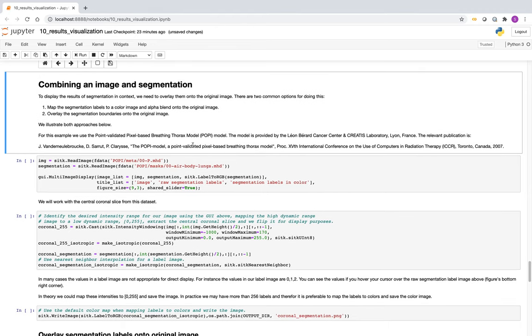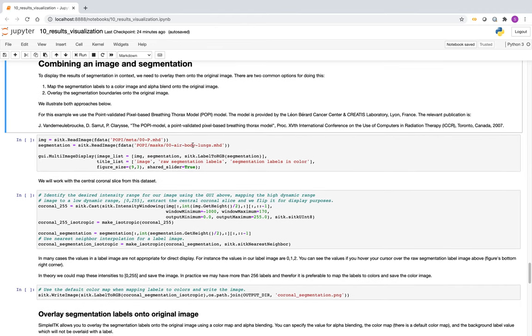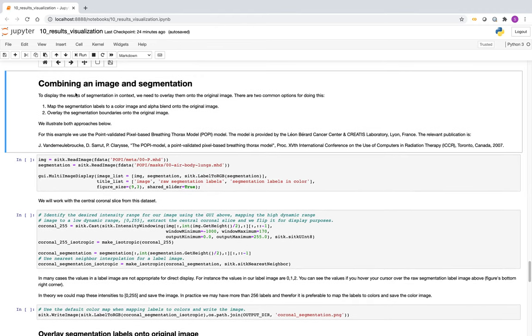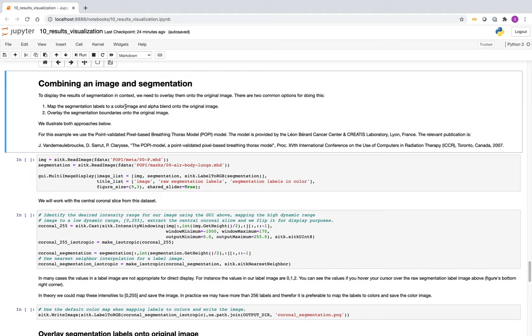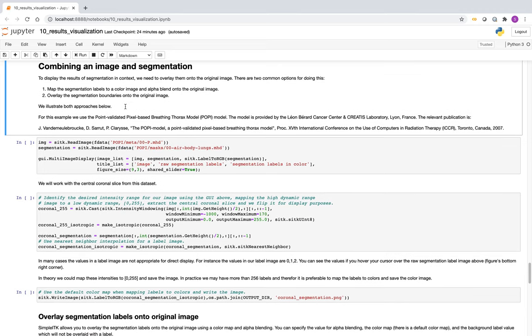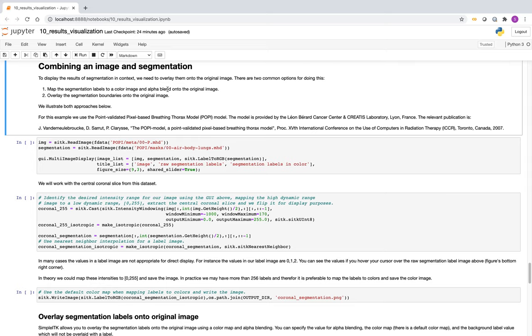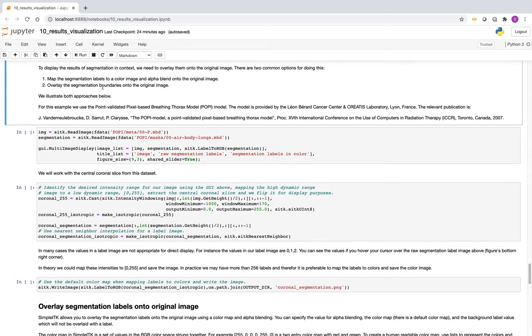And that looks very, very different. Again, we're overlaying exactly the same data. So you can understand, this essentially highlights that your choices of how to visualize your results actually have a significant effect on the impression you leave on your reader. Because these, the two images that we just, two choices of how to display exactly the same data, really create different impressions. Again, you can play around with the mask, basic, per pixel alpha, and overlay your images. Now, when we want to combine a, this is now we're combining an image and a segmentation. In the previous, all the previous examples showed how to combine two images. Each of them was, they were commensurate and that image one and image two didn't have any specific meaning to them. It's just two images. Here, we have an original image and we want to overlay a segmentation on it.